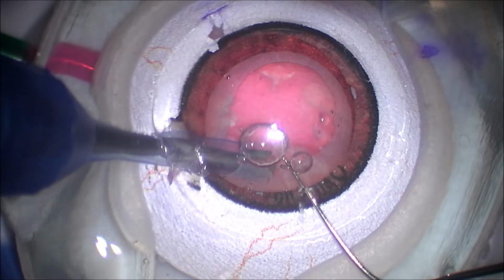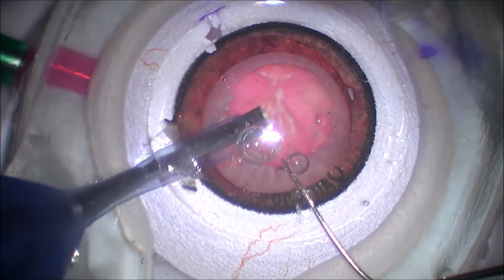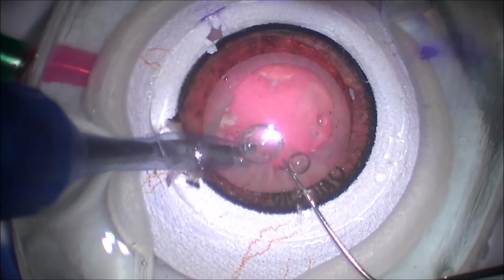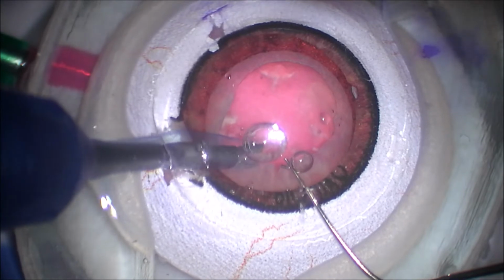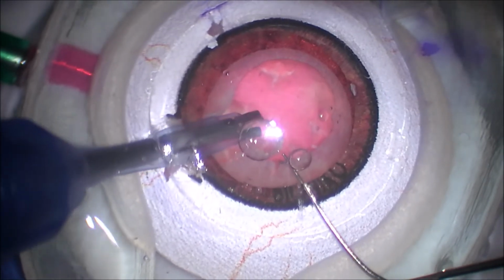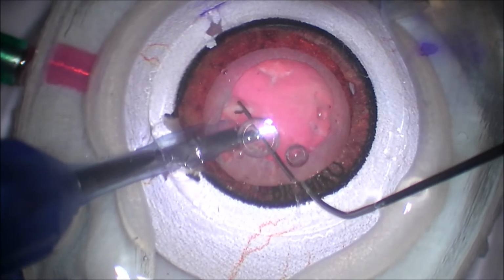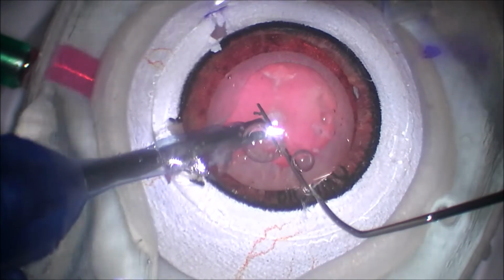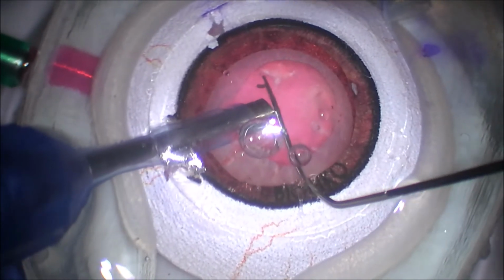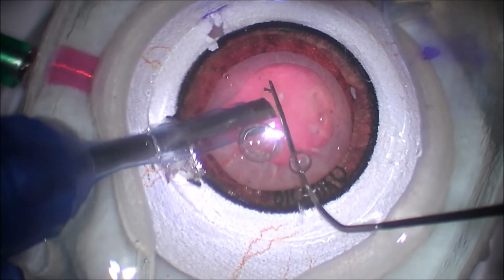She's being very methodical in using the phaco tip and leveraging the aspiration and vacuum so that she can grab those pieces even though they're sub-incisional. And again, she's using the Maltzman to very carefully tease those pieces up out of the bag. And I think she's actually doing quite well using both hands to very controllably manipulate those pieces out of the bag and then aspirating them and emulsifying them with the phaco tip.